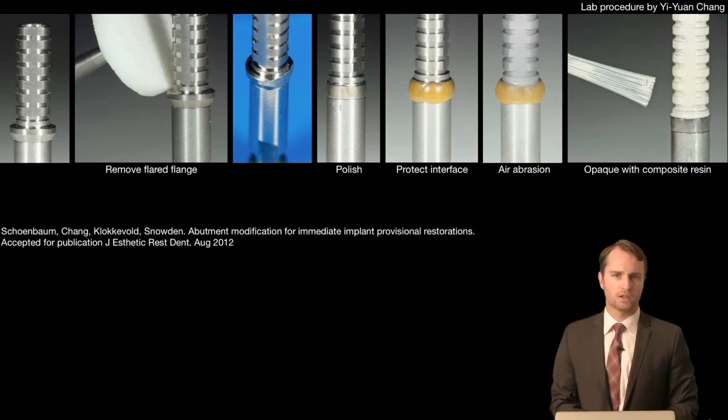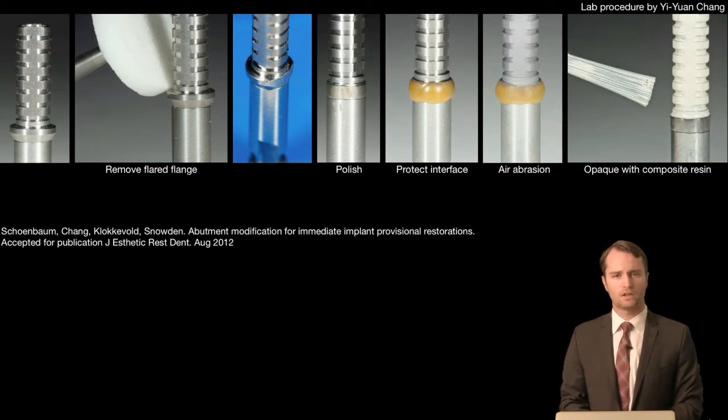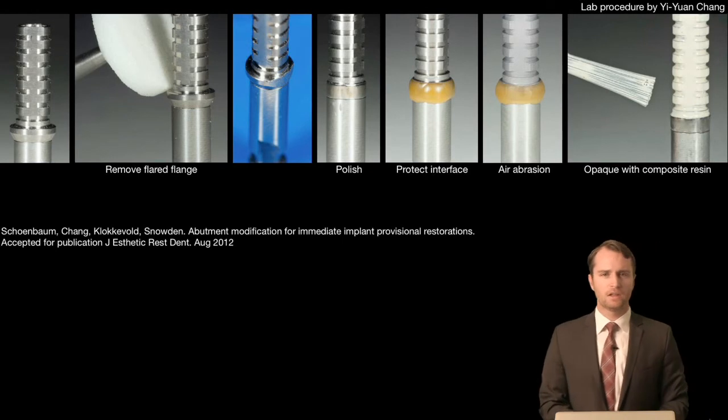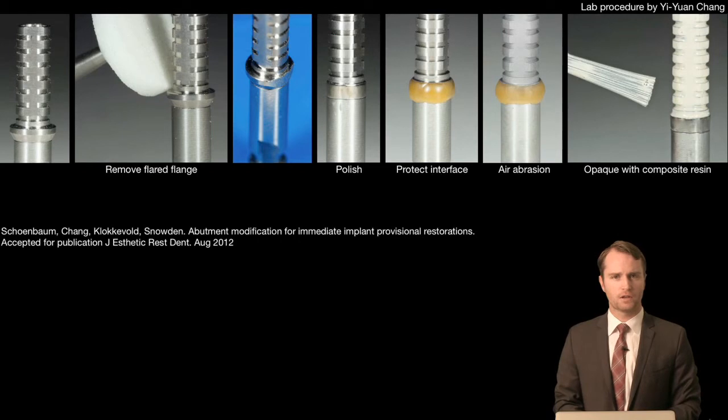It's a light-cured resin component, and it will enable the restoration to be ready for the luting to the provisional shell in the next step. Again, these steps are typically done prior to the day of surgery and prior to the day of fabrication of the provisional.